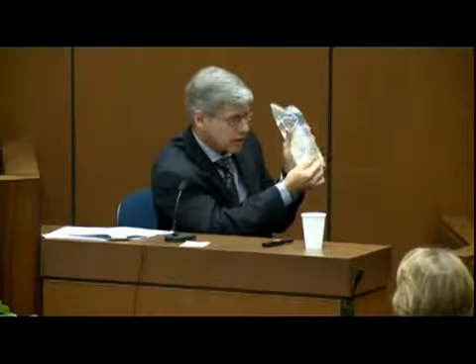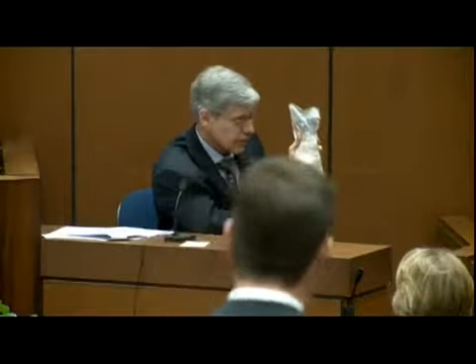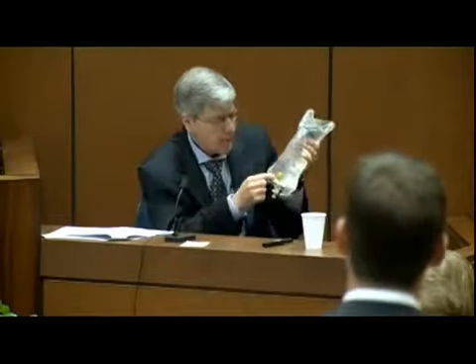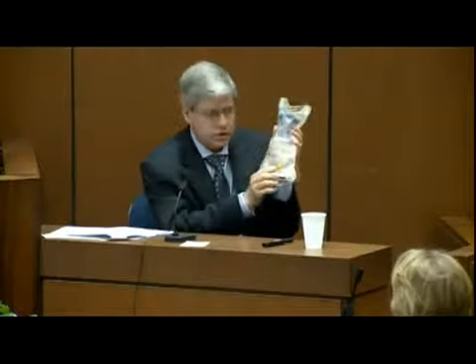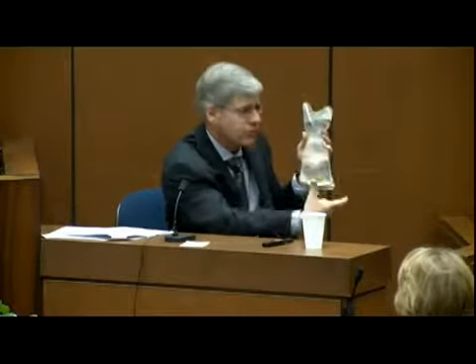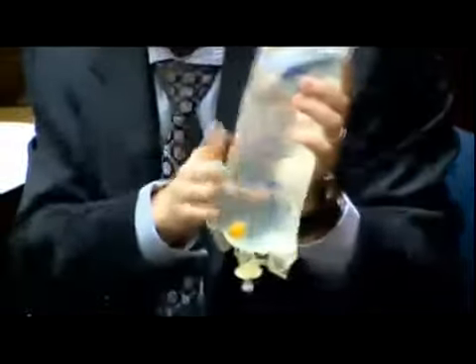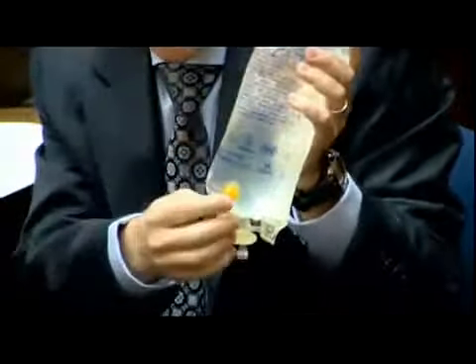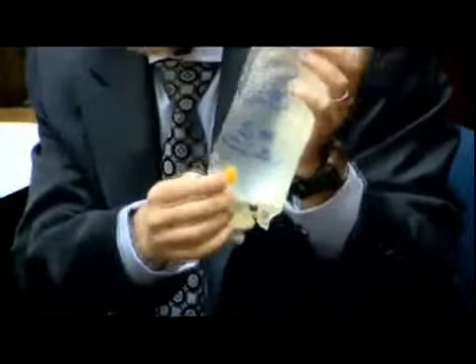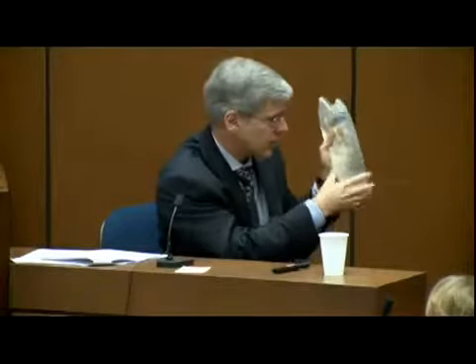This port right here, this is a kind of rubber that you can stick a needle into. I'm referring to this orangish port here. You can stick a needle into that and either draw saline out into a syringe, or for some reason you might want to inject another drug and mix it into this bag. So that's a way of accessing it. It's a special kind of rubber so that when the needle is removed, it self-seals, and you don't have a little constant leak coming out of that.